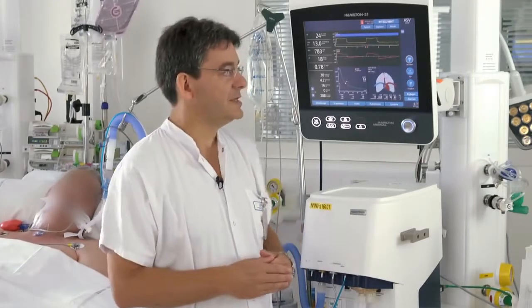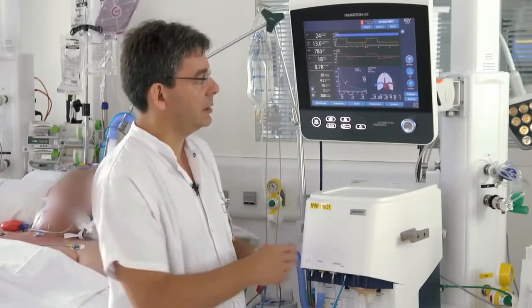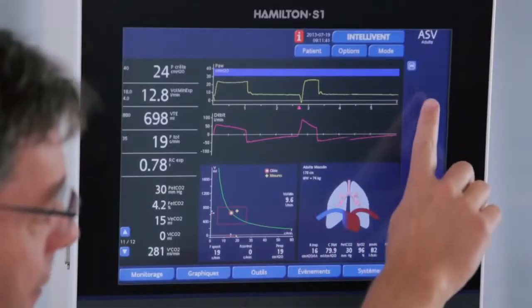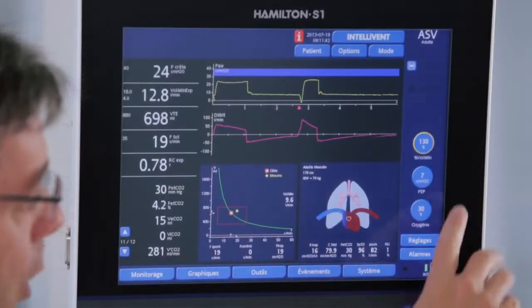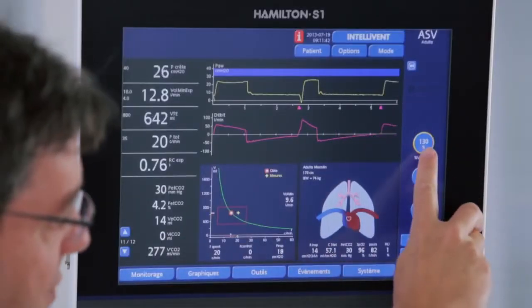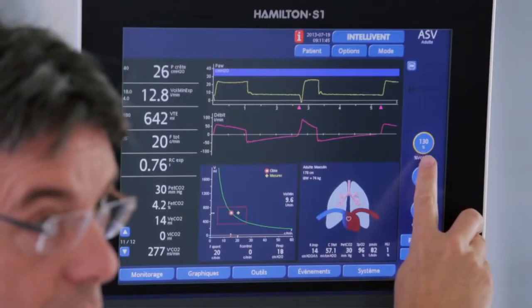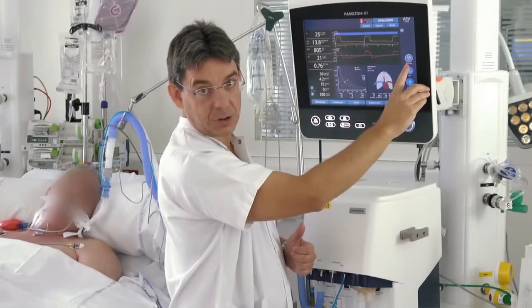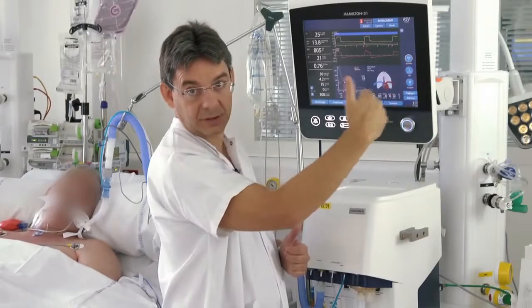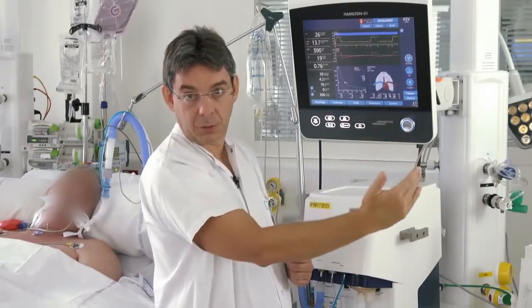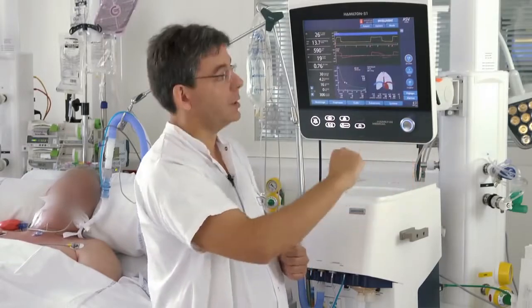This is a panel in ASV where we have to set the target minute volume in terms of percentage of normal minute volume.